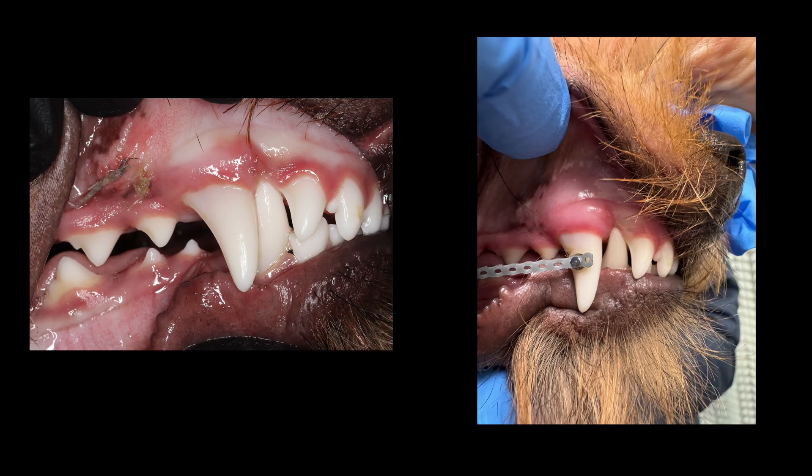After orthodontic correction, the moved tooth often wants to return to its original position. However, with this particular type of correction the bite is self-stabilizing, meaning you don't need a retainer. Once the lower canine is positioned correctly between the upper canine and the upper third incisors it will stabilize itself and won't move anywhere. Thank you so much for getting this course — I hope it will help your career and help you treat a lot of patients with malocclusions. I wish you great success.